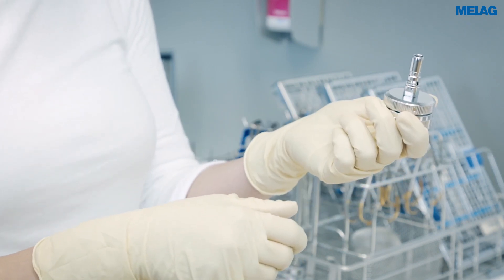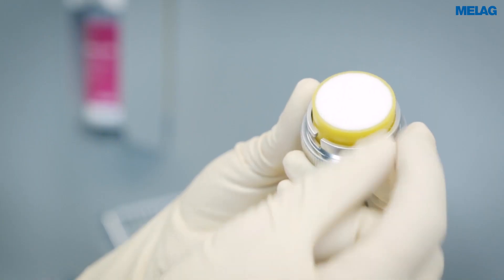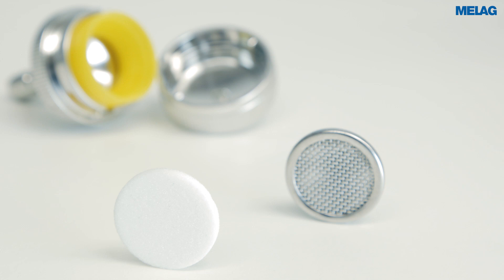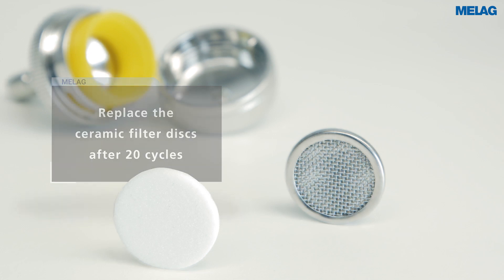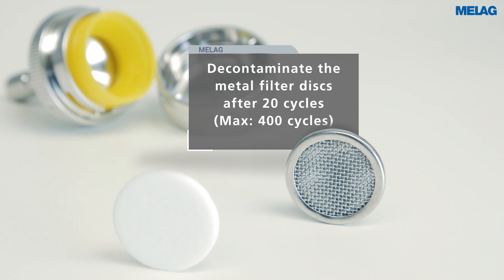A filter disc housing performs the necessary fine filtration of the water. You can use either a reusable metal filter disc or a ceramic filter disc to protect the instruments. Whereas the ceramic filter disc must be replaced after 20 cycles, the metal filter disc can be cleaned in the ultrasound bath after 20 cycles and then reused.